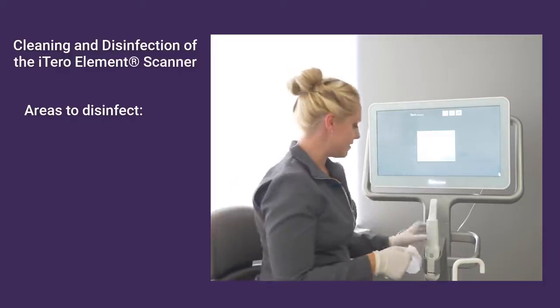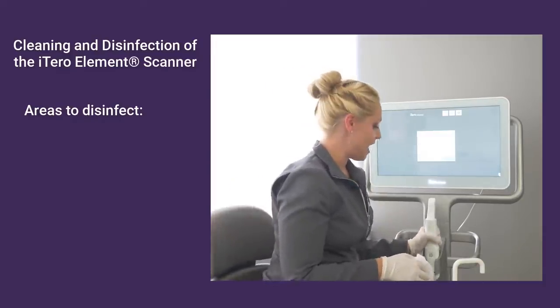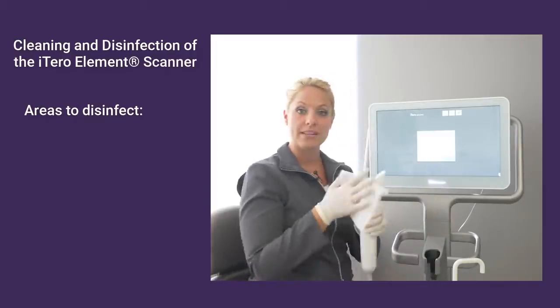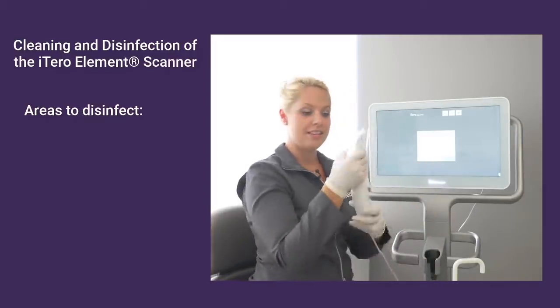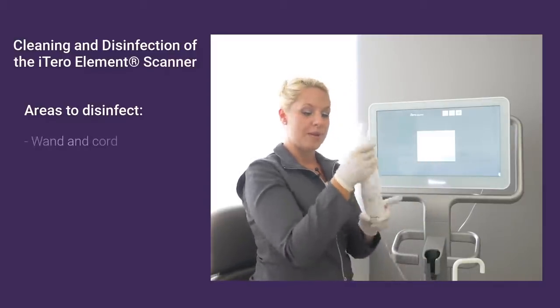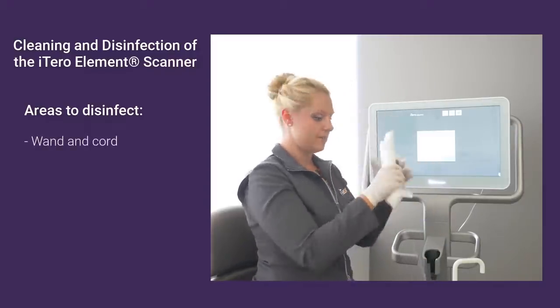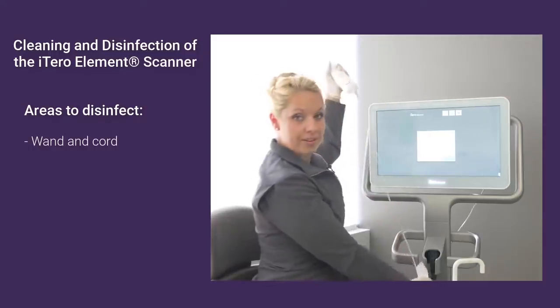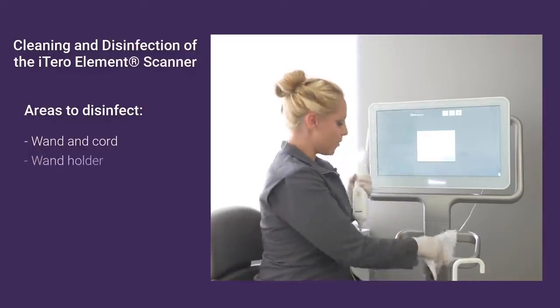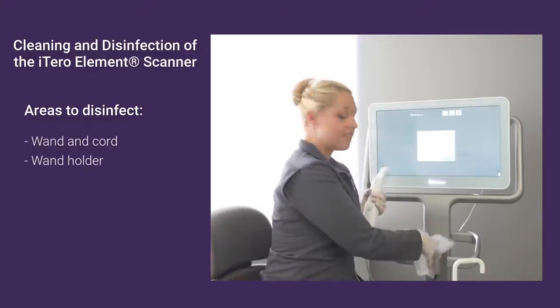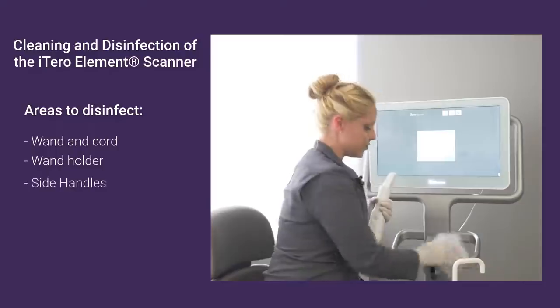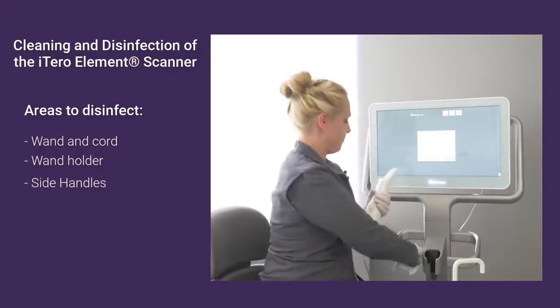I'm going to start with our wand. Everything is meant to get wiped down on the scanner. We can wipe the wand down all the way through the cord. I could wipe down the holder for the wand and the handles as well.